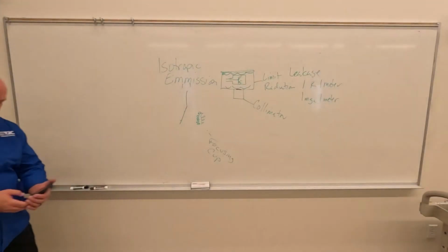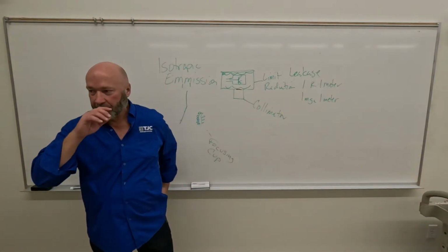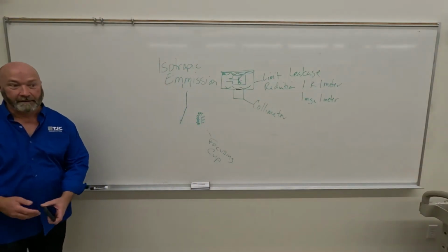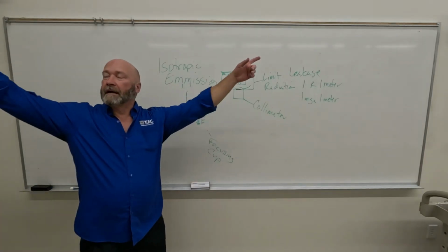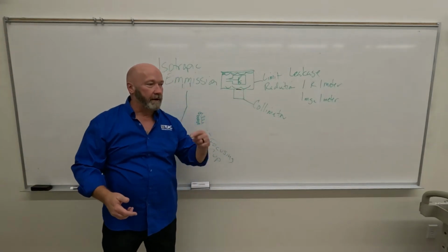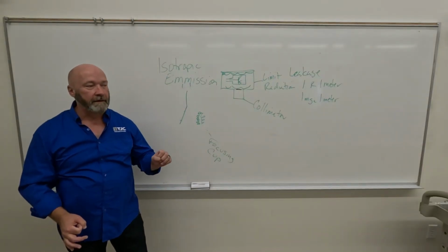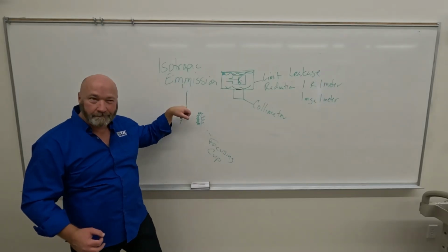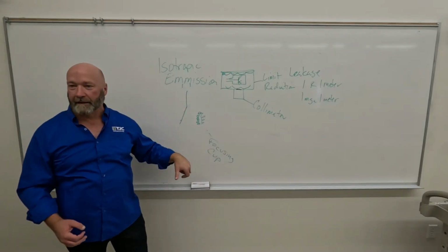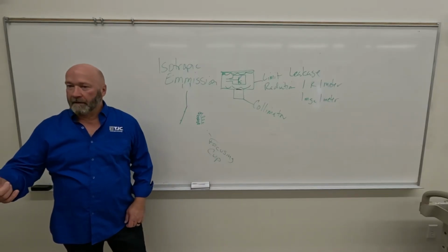Now, what I want you to do is hold your hand over your desk. What does your shadow look like? Hardly like a hand, right? Why? Because the light's coming from everywhere, right? As opposed to that. So the smaller the light bulb, the smaller the filament, the smaller the area of impact, and the smaller the spot that we create X-rays, the sharper the image is going to be, okay?